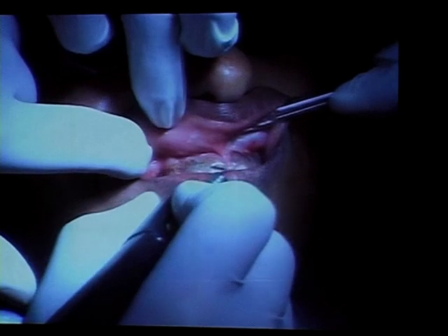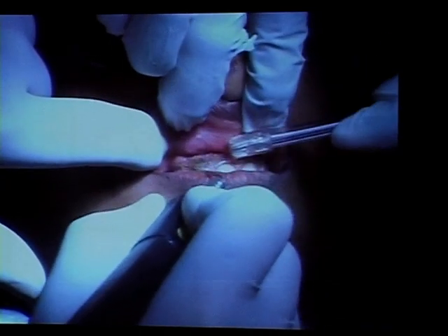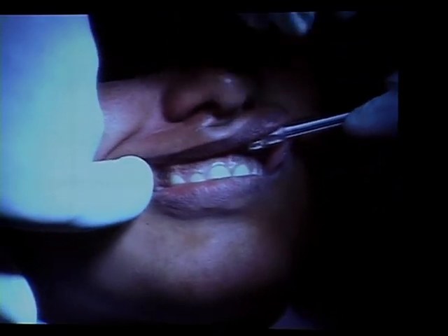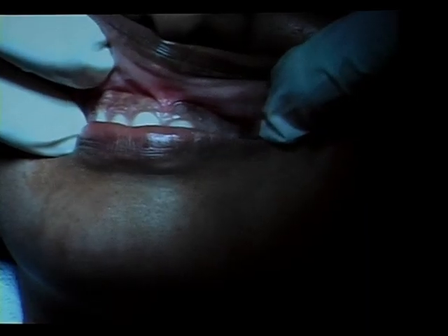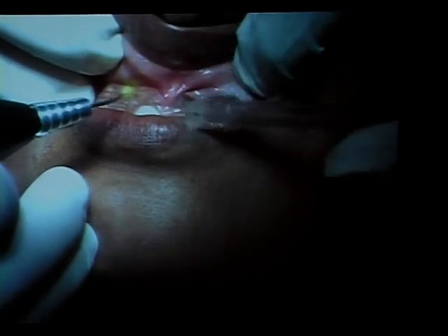And you can actually see the melanin pigmentation slowly disappearing as we go into the pigmented areas of the mucosa and we are ablating it. The effect of the diode laser is also more effective the next 2 days, 48 hours down the line. It doesn't look like much now, because the absorption of the melanin is now going to slowly ablate it, and it's more effective when you see it 48 hours down the line.